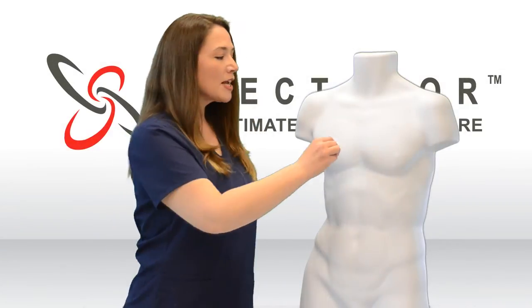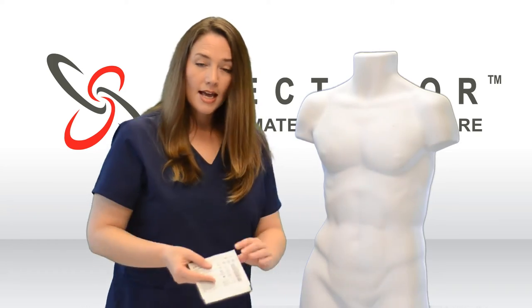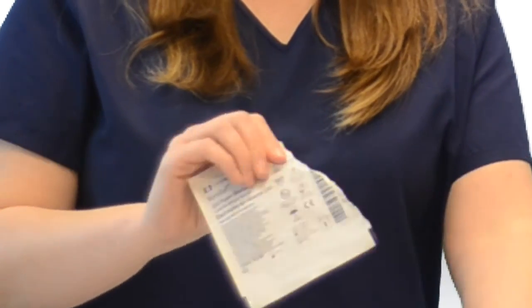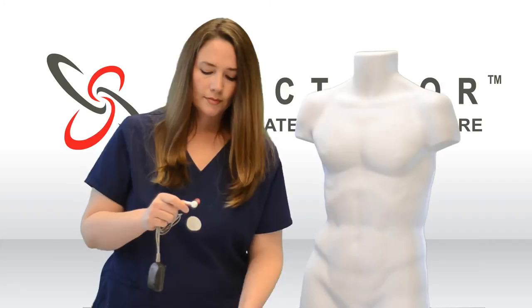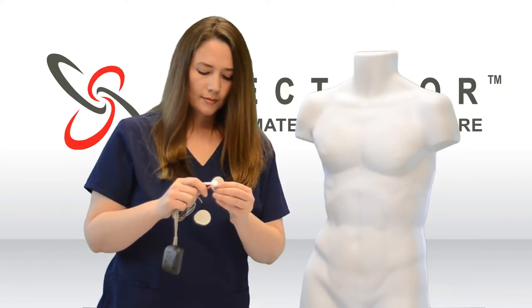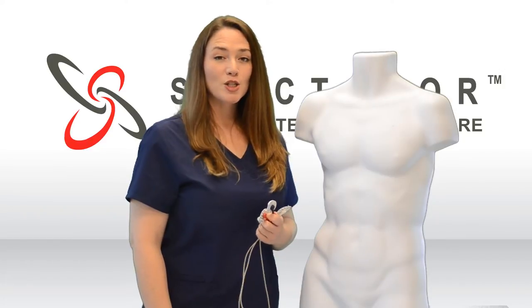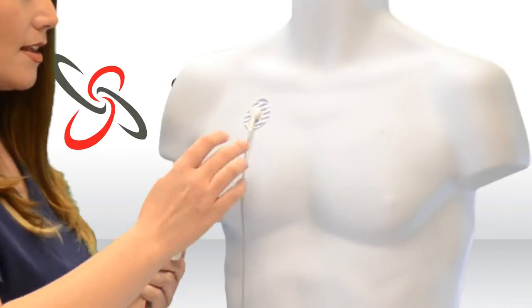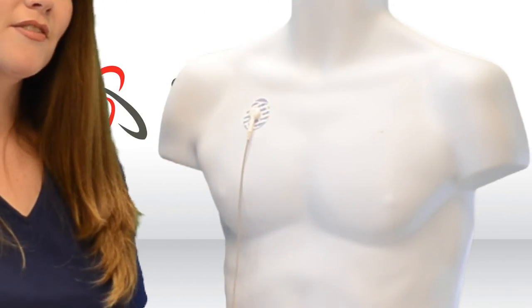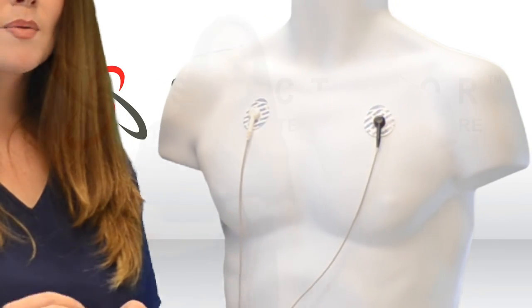First, make sure the patient's skin is clean and dry. Next, take a package of electrodes and attach one to the end of each lead on the heart monitor. Now place the electrodes on the patient's chest: the white goes to the right, the black goes to the left, and the red goes to the left rib area.